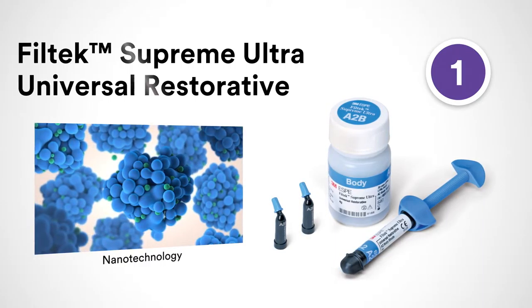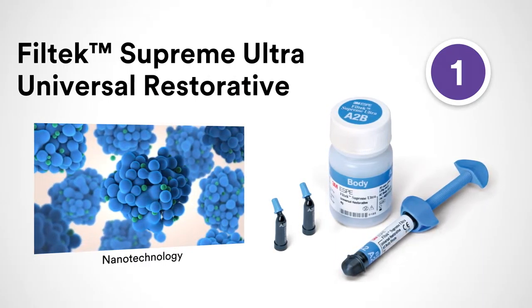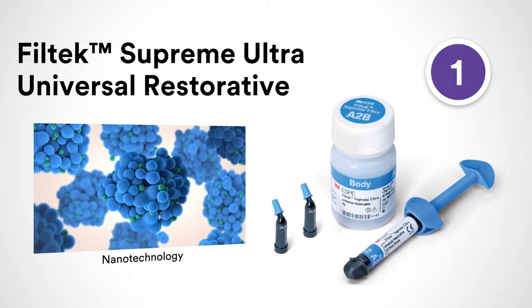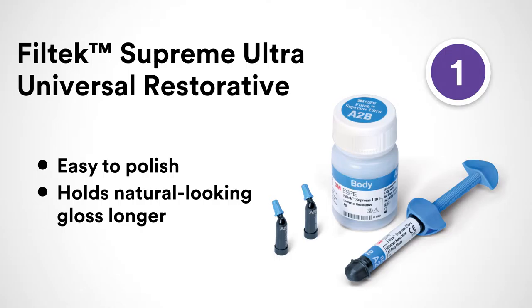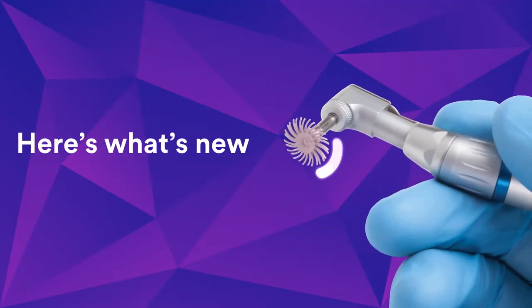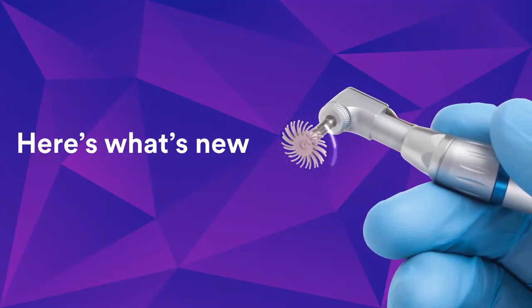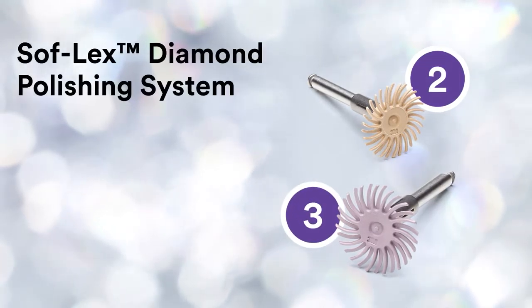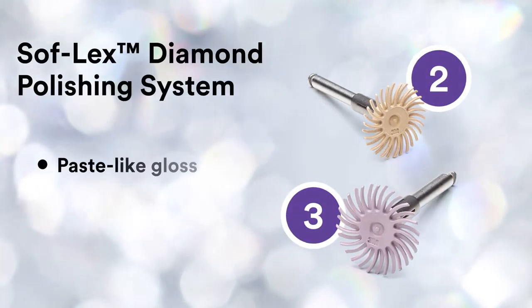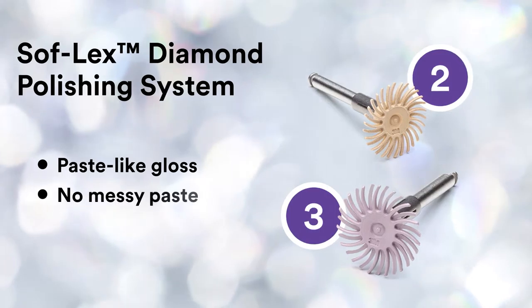You'll start with the nano composite that's capable of delivering exceptional aesthetics: Filtek Supreme Ultra Universal Restorative. 3M's patented nano technology is easy to polish and offers unsurpassed polish retention. Here's what's new — it enables you to achieve highly aesthetic restorations with simplicity, leveraging 3M's unprecedented history in abrasives. We created the Soft Flex Diamond Polishing System.